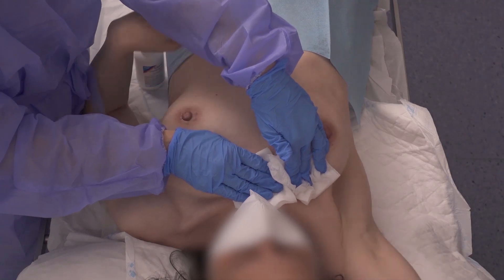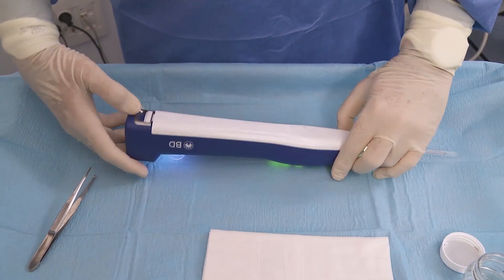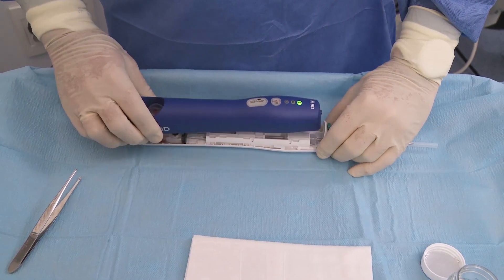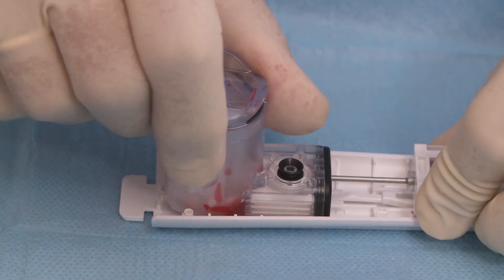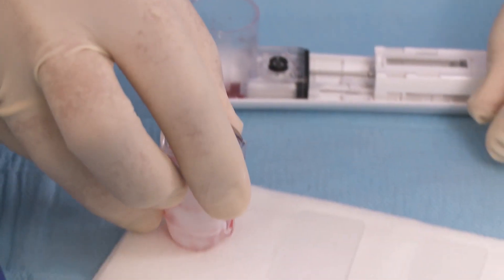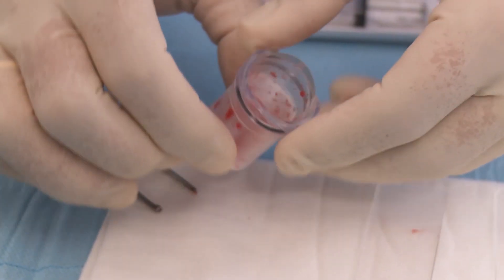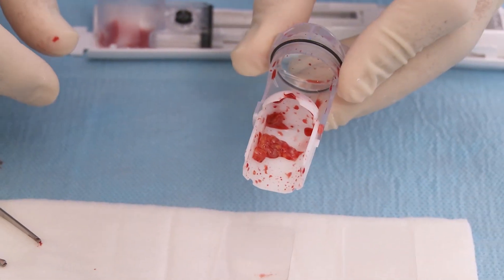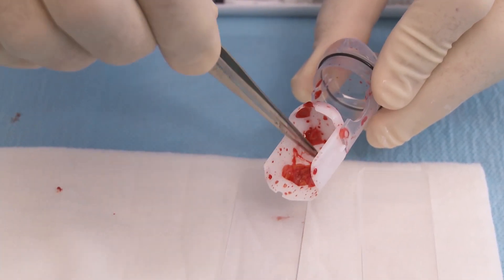While patient care actions are in progress, the probe is detached from the driver and the sample container is detached from the probe. Alternatively, the sample container can be detached first. Carefully open the sample container to remove the samples and immerse them in formalin, or the whole sample container can be immersed directly in the dedicated formalin container.